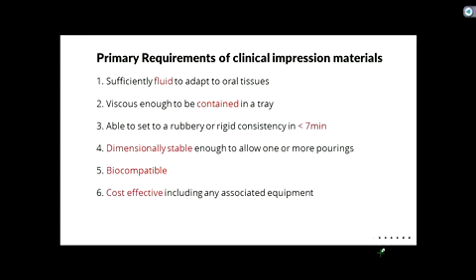It's able to set to a rubbery or rigid consistency in 7 minutes or less. The point is you want the patient to be comfortable. You don't want them standing around for half an hour for this thing to set. And it's got to be dimensionally stable enough to allow for one or more pourings.